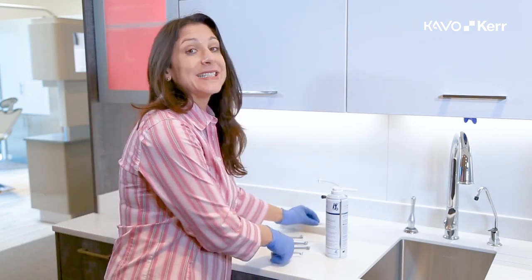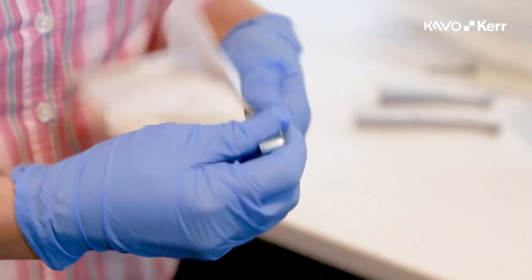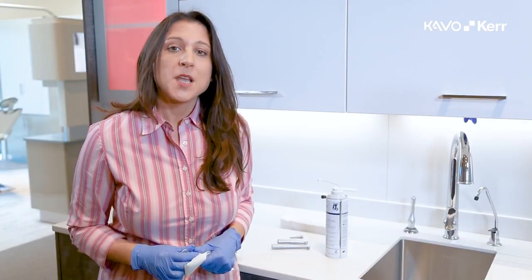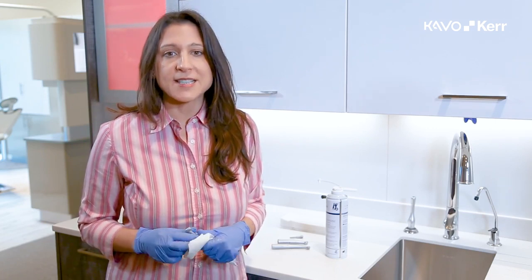First, wipe down your handpiece with a damp towel. If there is still some bio burden left on the handpiece, clean under running water using a brush. A mild detergent is acceptable. Be sure that all bio burden is removed before going on to the next step.